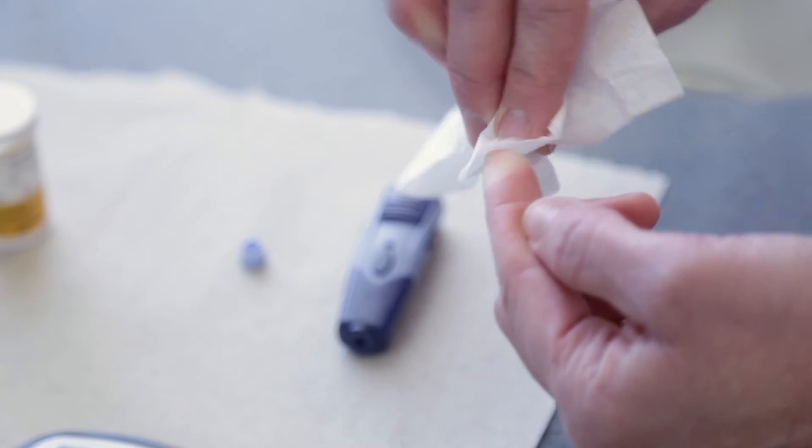Results will appear shortly. Wipe your finger with a clean tissue while waiting.